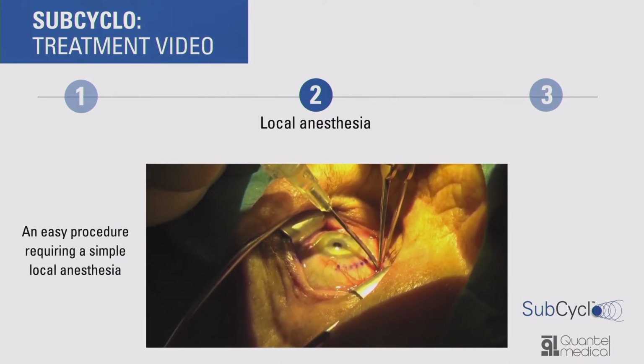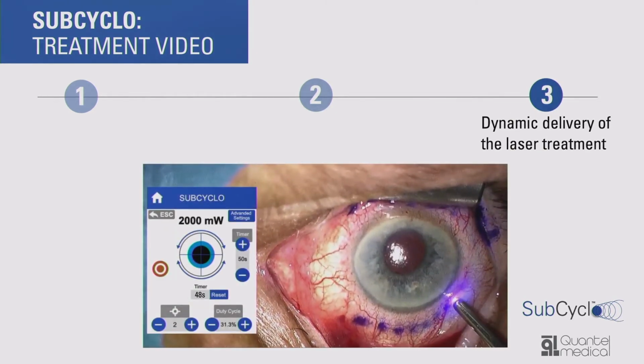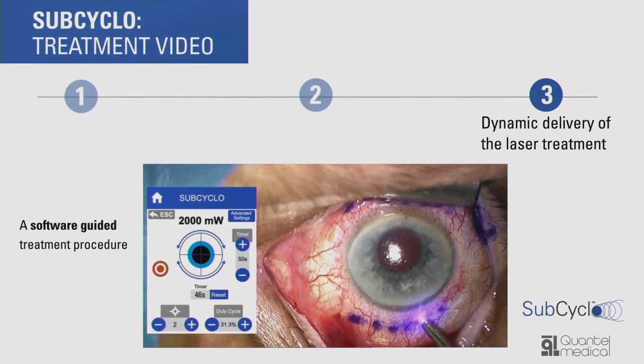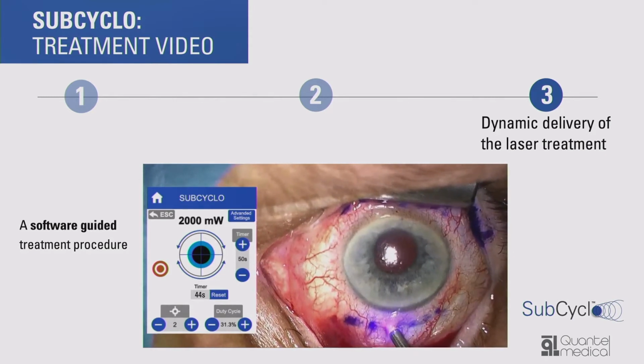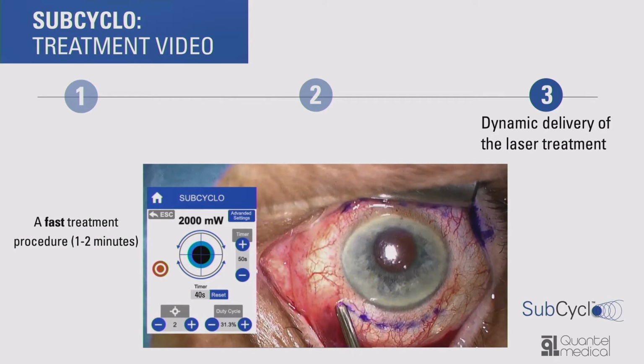We can use subtenon anesthesia or a periocular block. And it's so easy to move with this probe.